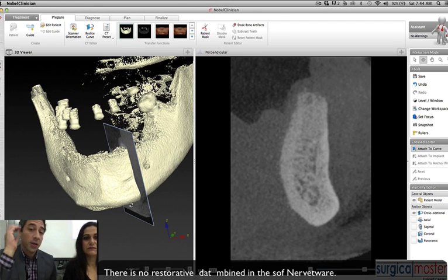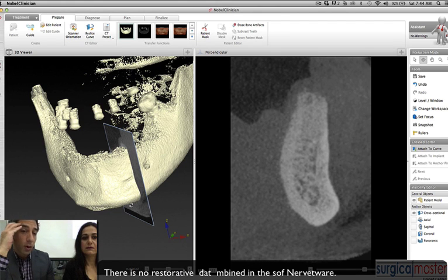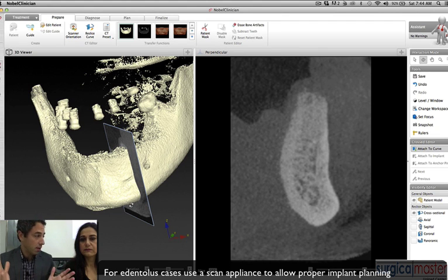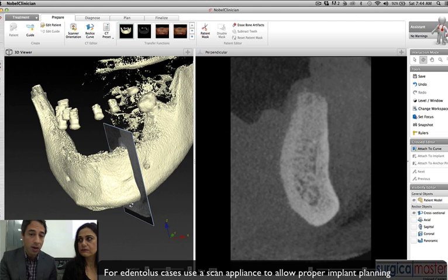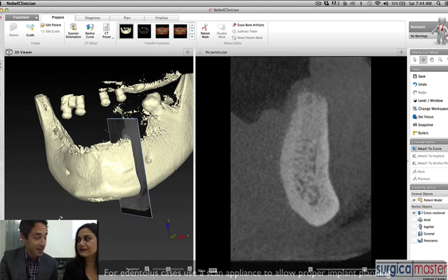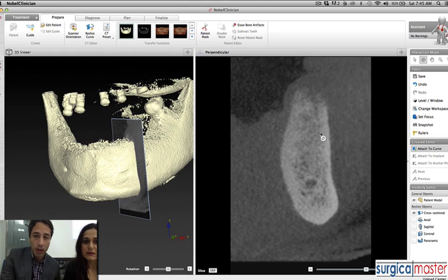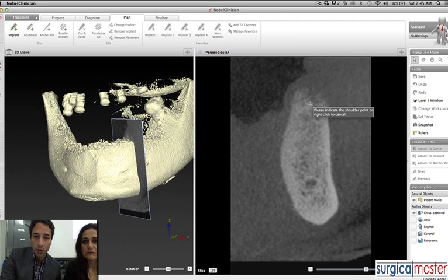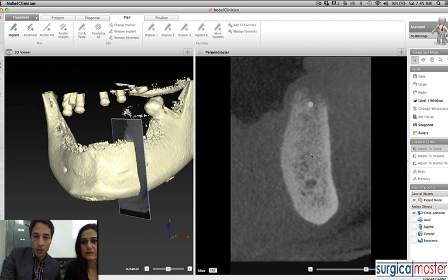What's missing here is where the teeth are going to be. In principle, you need some type of scan appliance that shows the teeth, because we're placing implants totally at random — but at least we know the measurements. So let's put an implant in there. The choice of implant is really yours.